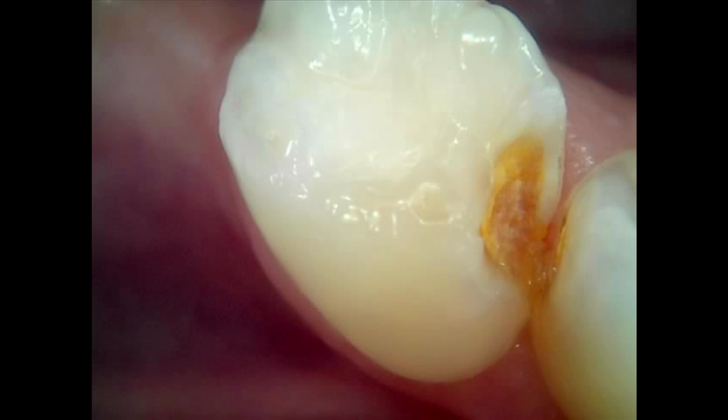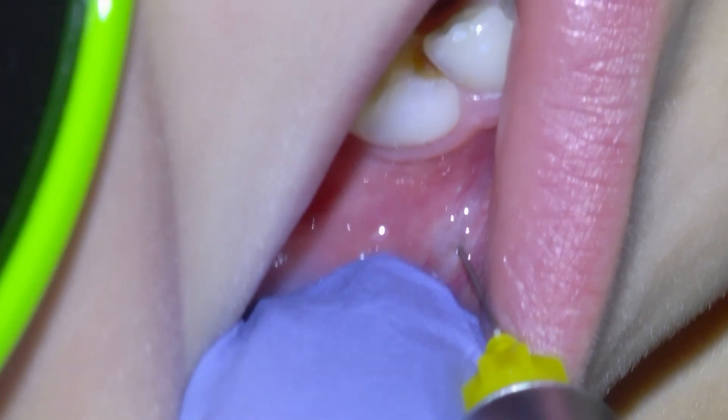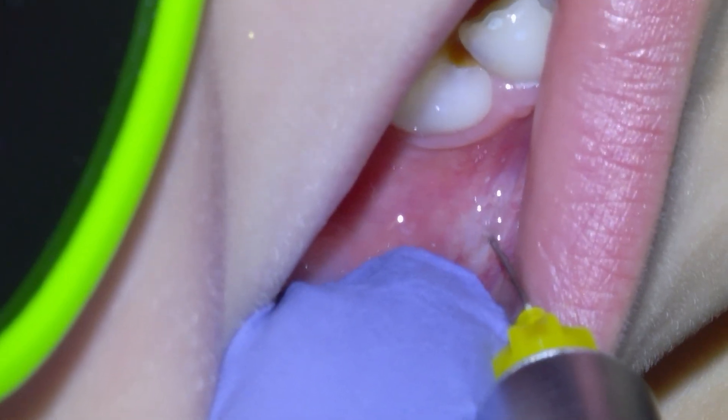This is pediatric tooth decay in a lower right first primary molar that we're going to fix. We're going to begin anesthetizing the tooth with 1 in 200 articaine, and this patient did fantastic with the freezing.